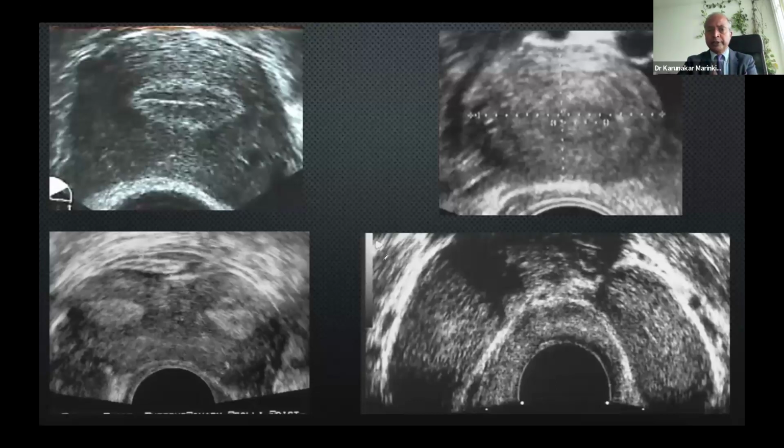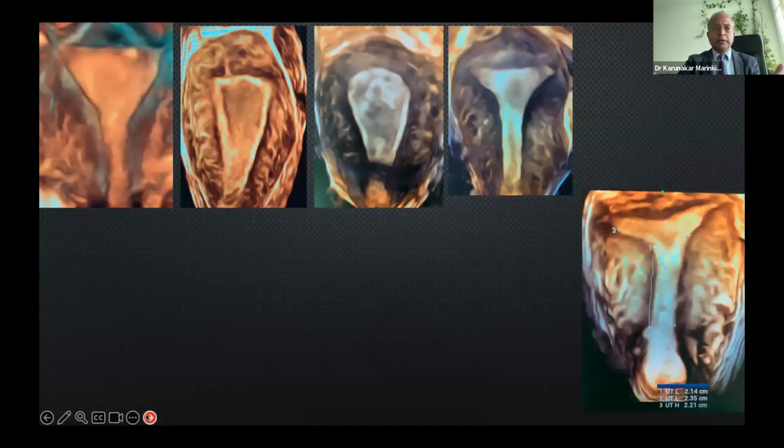Shape problems, as already discussed with you, this was my transverse view with a 2D. When the endometrium looks like an eye shape, like a pupil, even at the fundus, that is a unicornuate uterus. If it is split, it can be bicornuate or septate. You don't know that without MRI. If it is split so widely and you have bowel loops in the center, that is a proper uterus didelphys. There are huge variations in the normal endometrium. Please don't jump and give a label, trying to force a natural variation of the endometrial chamber into that.